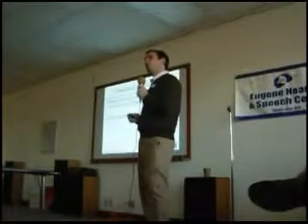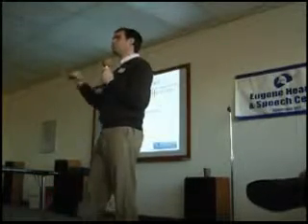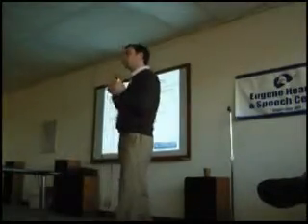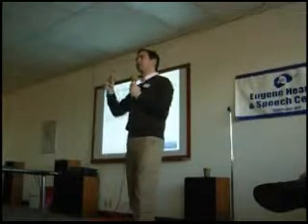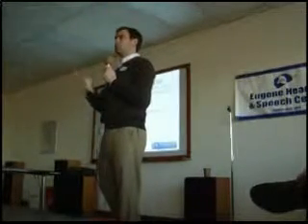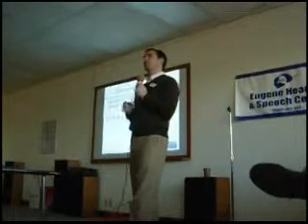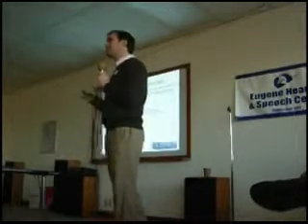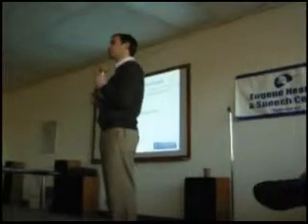So, when we look at channels, we look at what the hearing aid does on the inside. And you're not going to see that. You're not going to deal with that very much. That's how the hearing aid works on the inside. When we look at directional microphones, we look at something that you can directly control, or you can have the hearing aid do it automatically. Directional microphones is the one type of technology that all hearing aid manufacturers agree upon. There's not a whole lot of things that all manufacturers will say that works, but some things are. Directional microphones is one of them.